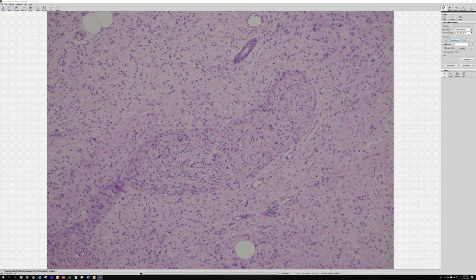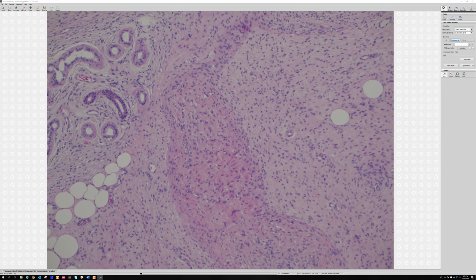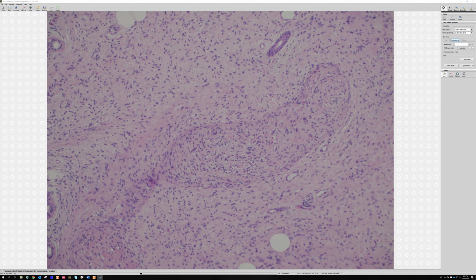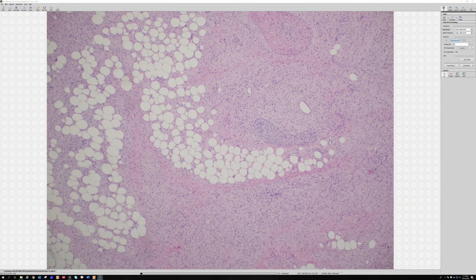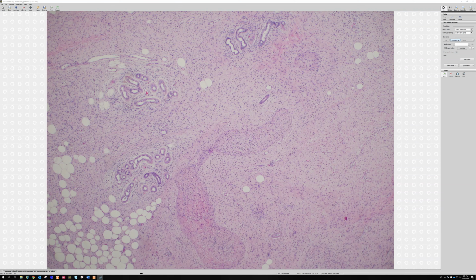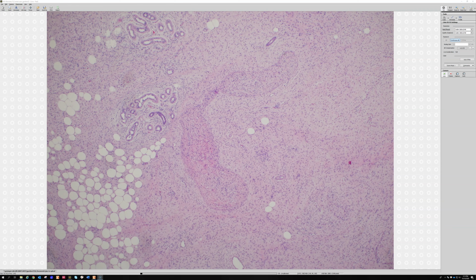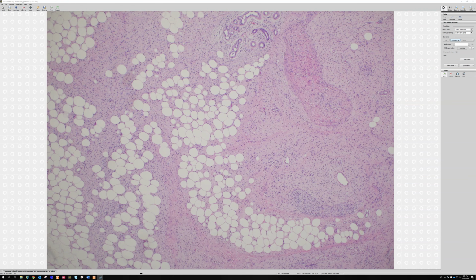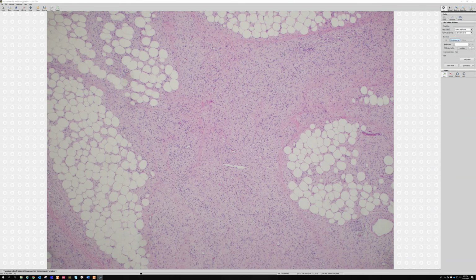And again, without any clinical information, I would never say, oh, that's plexiform neurofibroma, but this patient did have NF1. And in reality, you often do see in NF1 patients diffuse neurofibroma intermingled in the background between the trunks of plexiform neurofibroma. And I don't know if there was a larger, deeper plexiform neurofibroma under this or just a few expanded branches there. But I find those expanded nerve trunks really helpful to recognize. You don't always see this, but if you see something like that in a diffuse neurofibroma, that would not be something you would see in dermatofibrosarcoma protuberans.